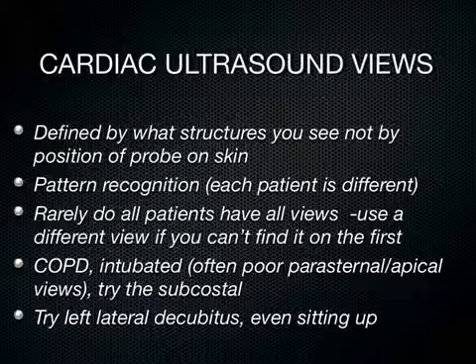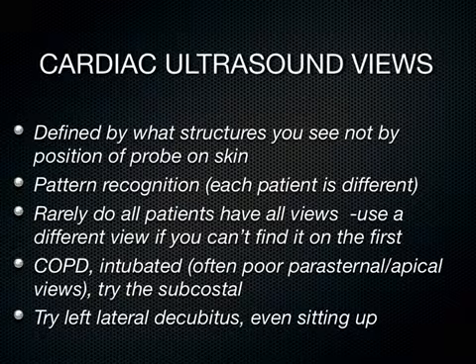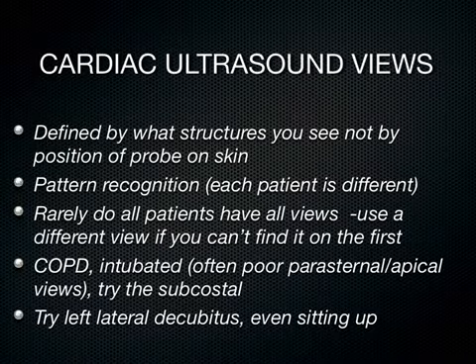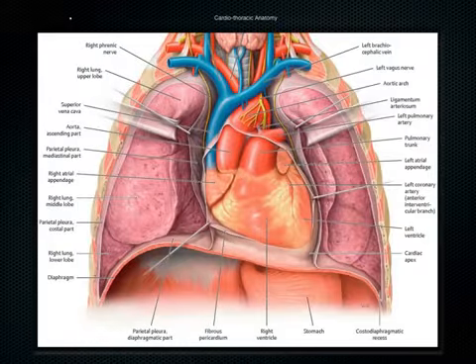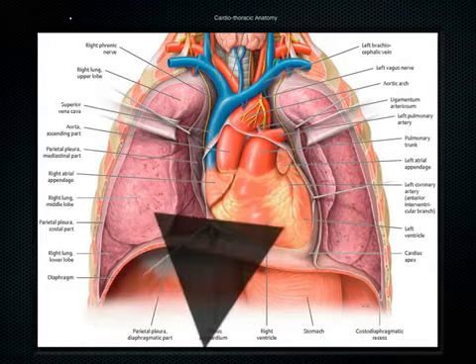And you watch a cardiac sonographer do an ultrasound. They always roll the patient. They stick a pillow under their right scapula and roll the patient left lateral decubitus, which brings the PMI to the chest wall. You can always get better views if you roll the patient to their left. That's the big secret here. Not unlike looking for the gallbladder, the liver is the window to see the heart. We use the liver as our window in order to see the heart.